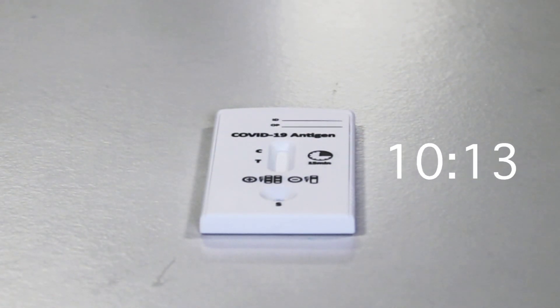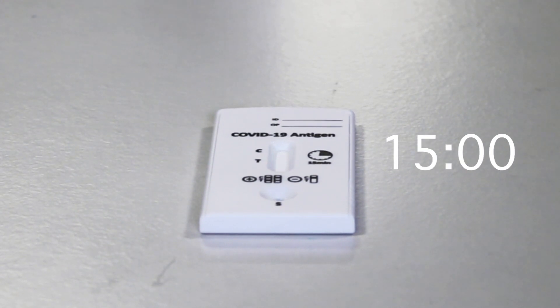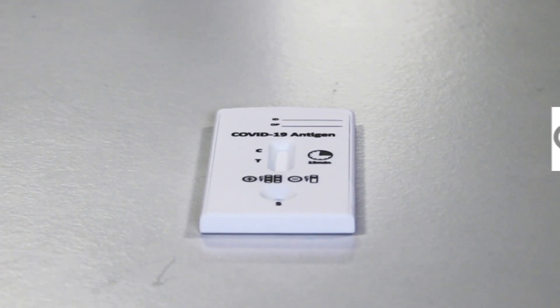Wait 15 minutes for final results. At the end of the 15 minutes, the test results are available.